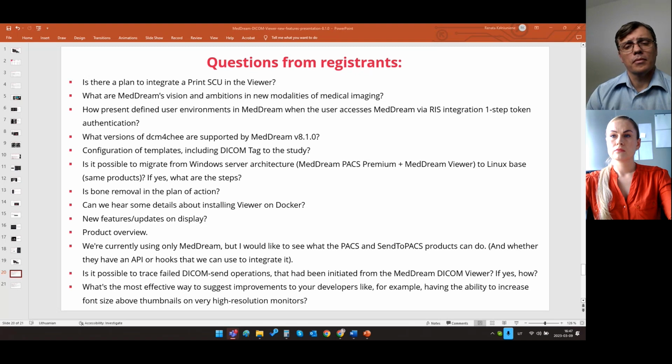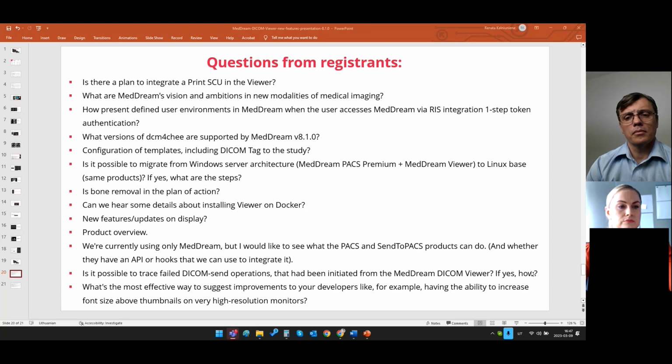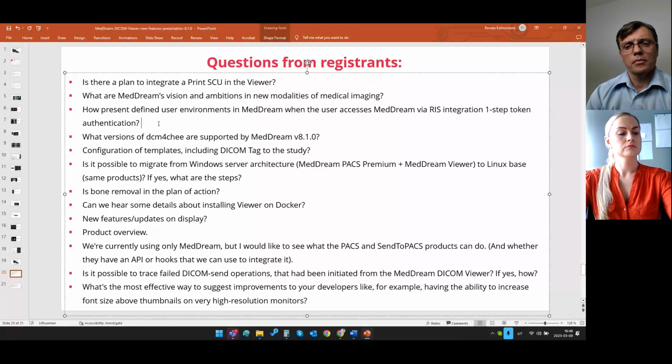I am just putting the link, and if you have any questions on how to integrate, there is our integrations email at softneta.com, so you can contact us and we can have a short call and set this up. To add to this, you can simply pass the user ID in the token, and by passing the user ID, you can load a specific global JSON for that user.